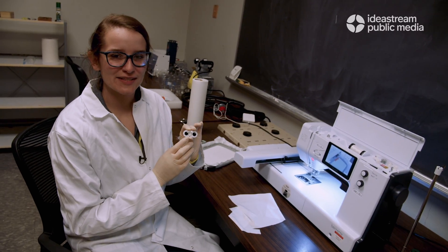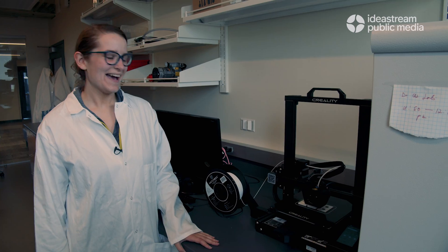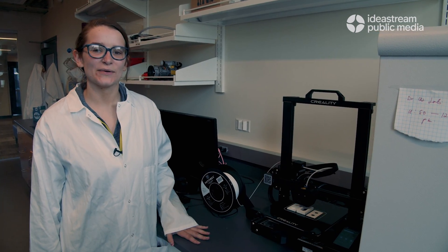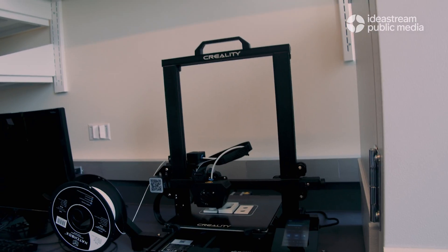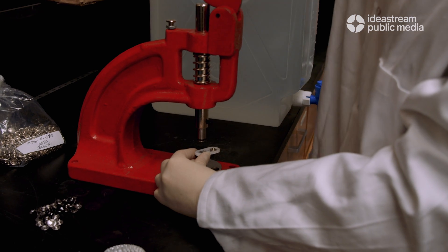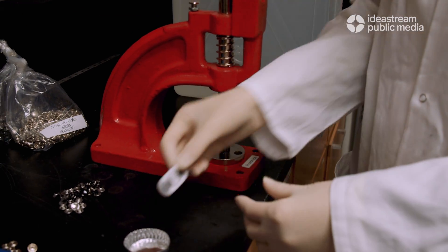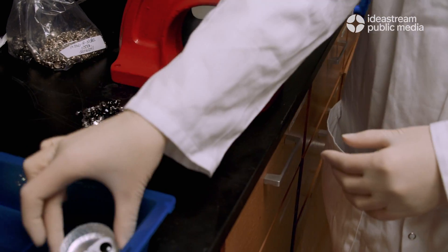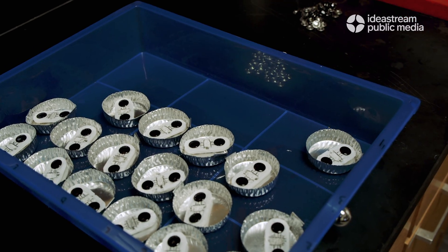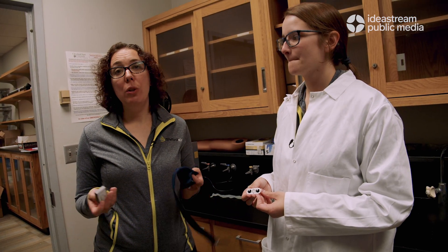Next we take our non-woven sensor piece and make it into what we call an assembled sensor. After we finish embroidering the sensor, we attach a 3D printed backing piece that helps give some stability to the sensor. Then we use our snap press to attach two snaps on each side, and from there we have a finished product like this.